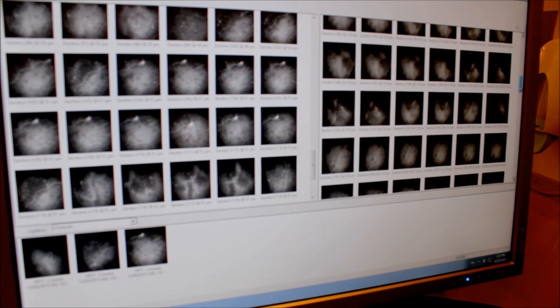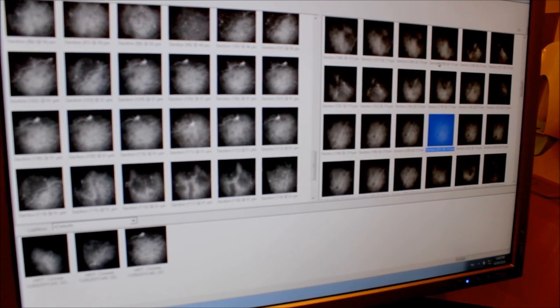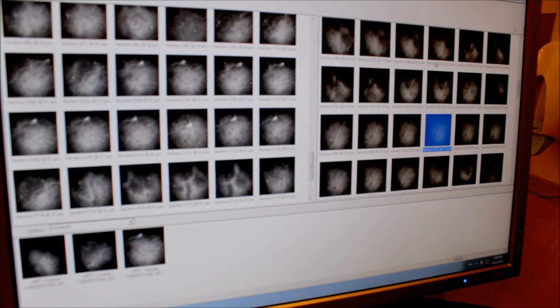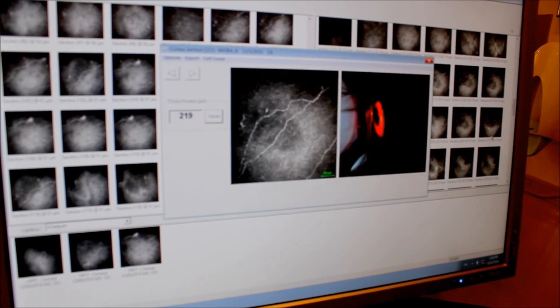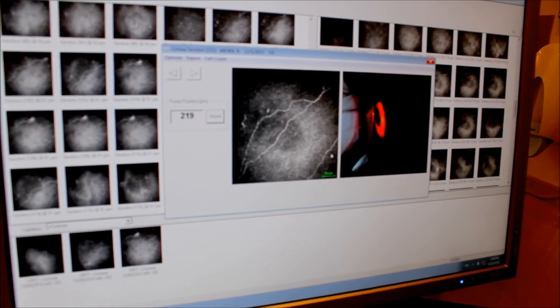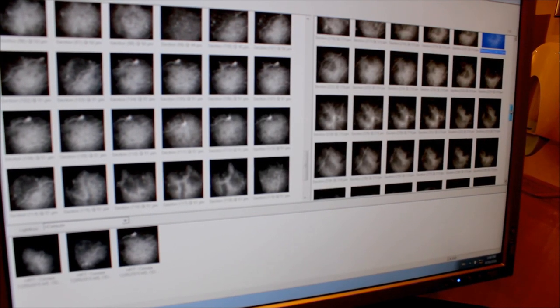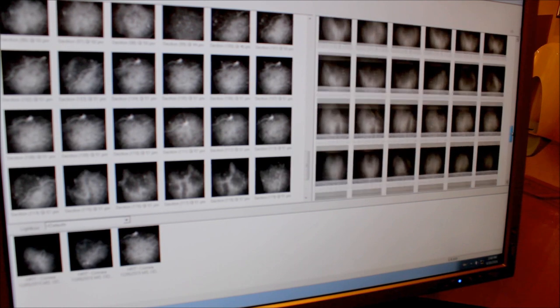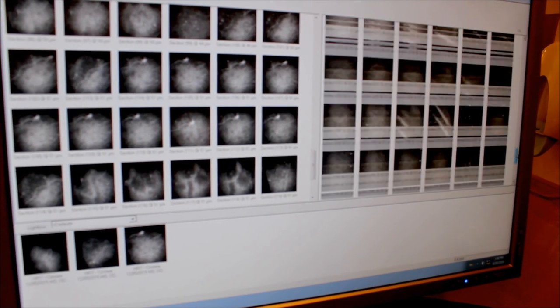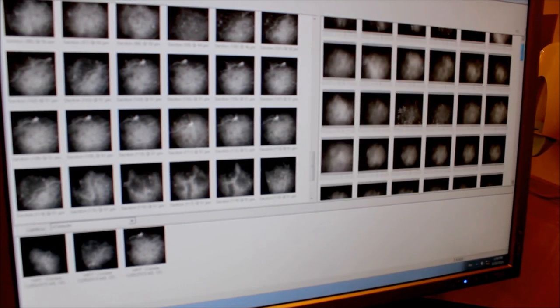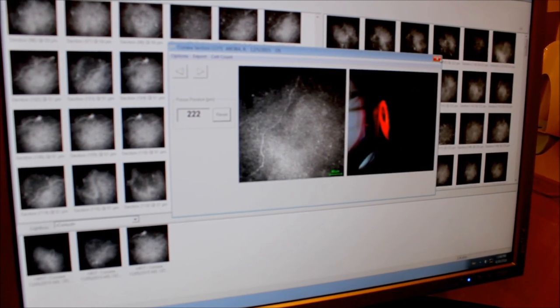You will see most of the images contain about two nerves. So I think the images with two nerves is going to be probably our average, like the other eye. But then you will see images containing more nerves, about four — one, two, three, four. Let me scroll further down. So what I'm going to do in this case is to choose my image with one nerve only as my minimum.